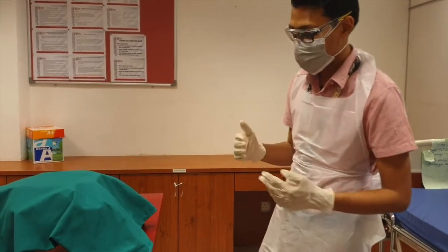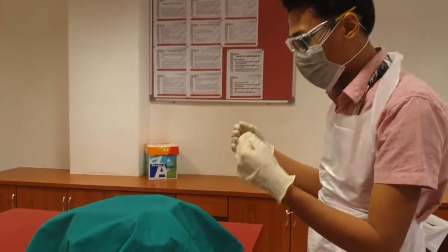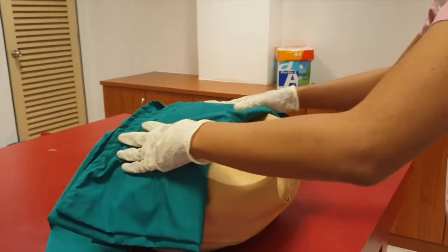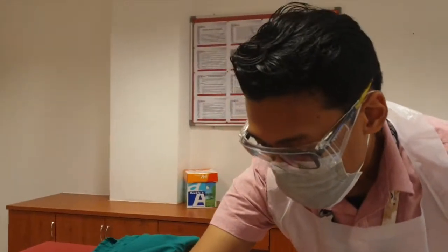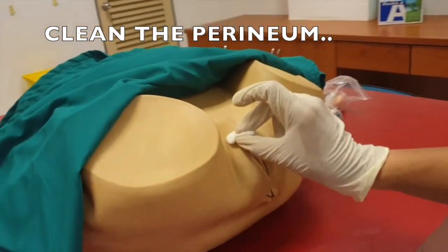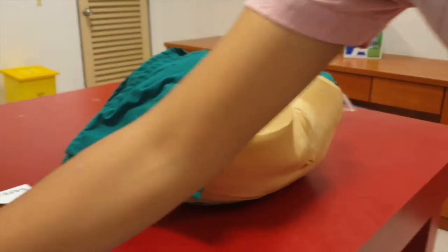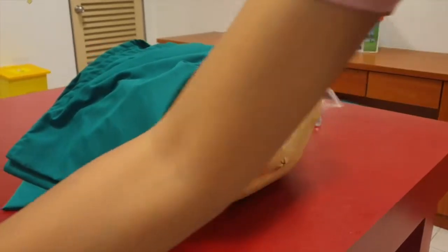Of course, now I would ask permission: okay puan, saya akan buka lapik sikit bawah ni. I will expose the perineum region. Once I expose it, the first thing I would like to do is clean the perineal region using a cotton swab and sterile water. Make sure when you clean it, do it in one direction, anterior to posterior, and then discard. You discard the cotton, take another one, clean it in the same direction, and again with the other one.